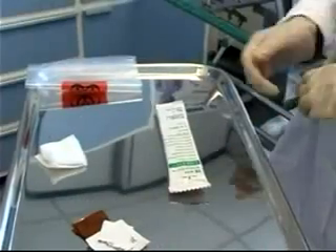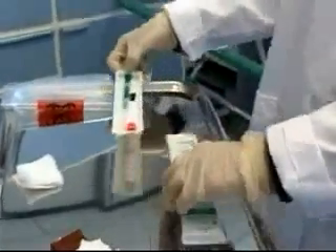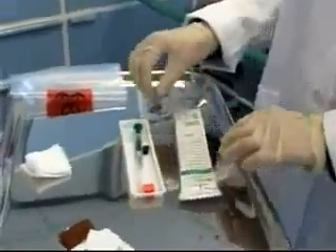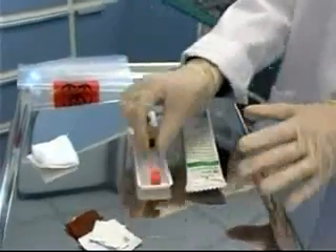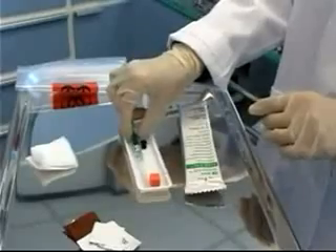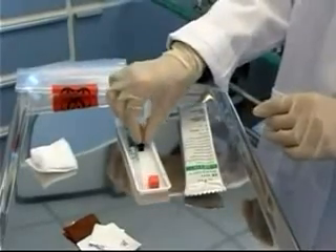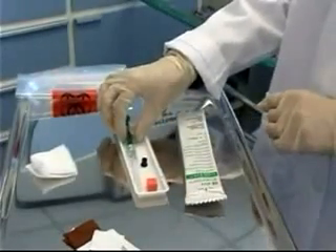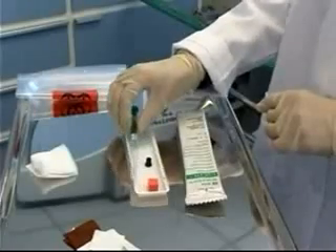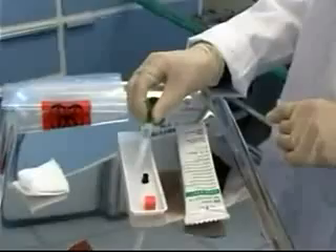While waiting for the skin prep to dry, open the blood gas kit. The kit is made up of three different pieces: first, an orange air ball used to expel any excess air from the syringe; second, a black cap to go over the syringe for transport to the lab; and third, a 3cc heparinized syringe with a needle attached.